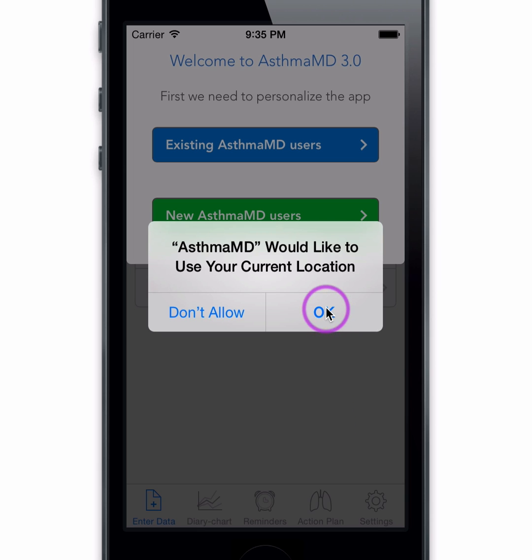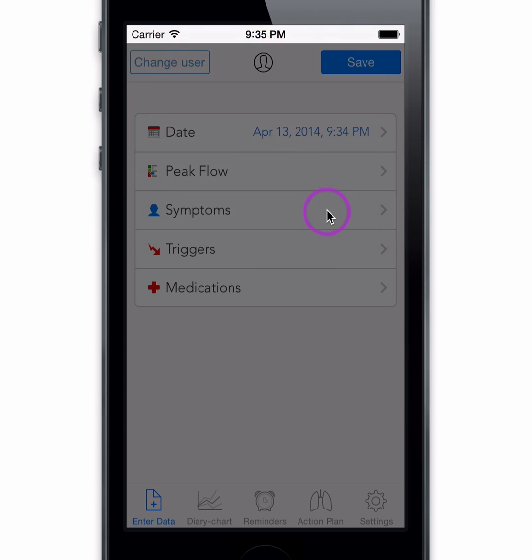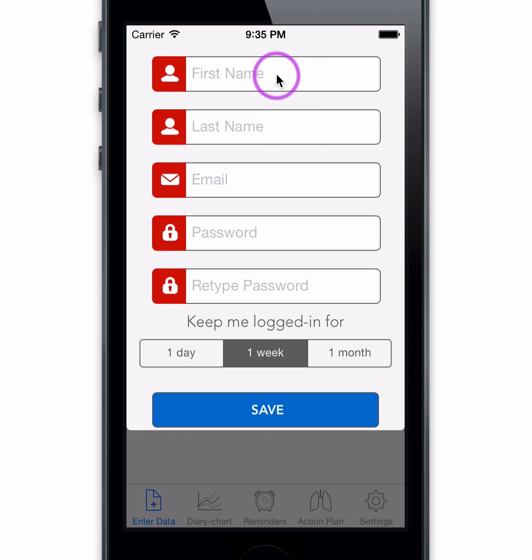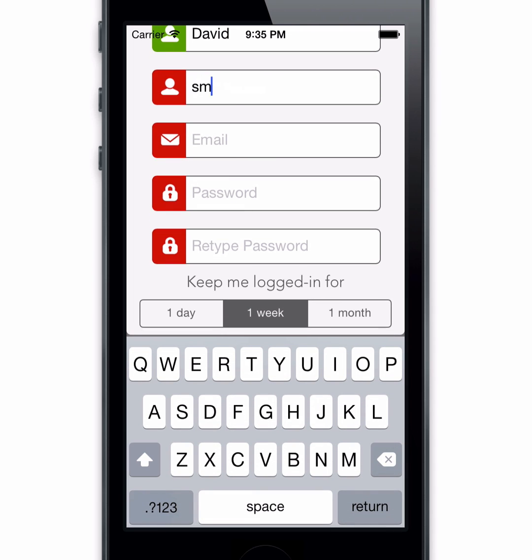When you first start AsthmaMD, be sure to enable your location. This information is very helpful to identify areas with high asthma activity. To personalize your asthma management, first we need to provide AsthmaMD with a few parameters.